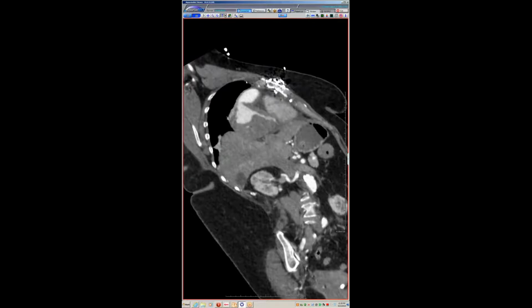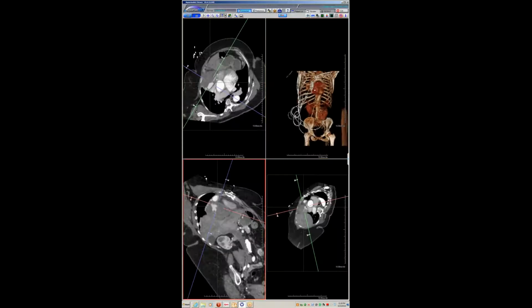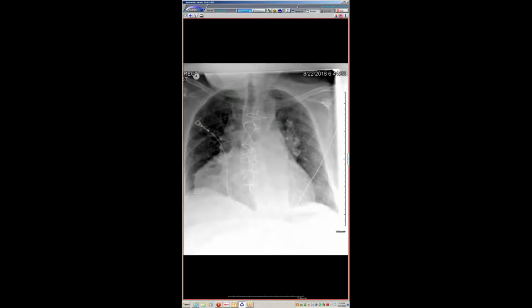Yours is more impressive. But I took exception to one of their questions, because they say that the chest radiograph is not specific for it. I would argue it actually is. Yeah, and when you look at them, I agree. When you look at this radiograph, especially the ones I've had that are saphenous to obtuse marginals that sit right here, you can see the adjacent clips. It's clearly mediastinal, has that very smooth contour, like this has a smooth contour.